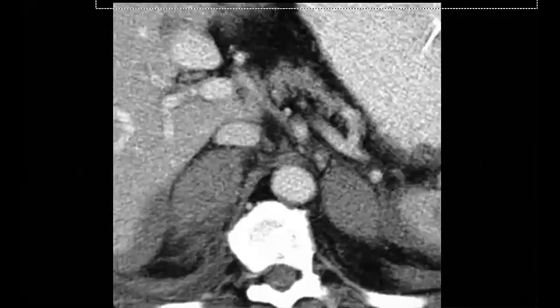Yeah, so do you have any other differential? Yeah. Perfect. So metastasis, Nermeen, Ines, Majida, nice. And what else? Yeah, it can be. Okay. Any other differential?